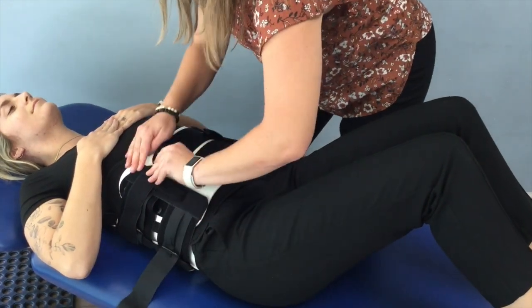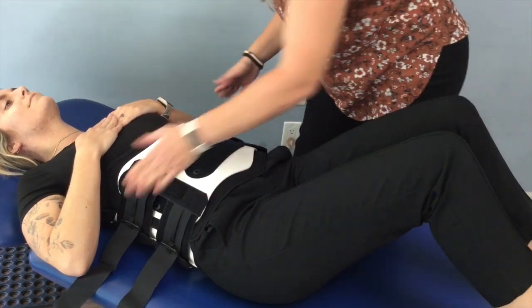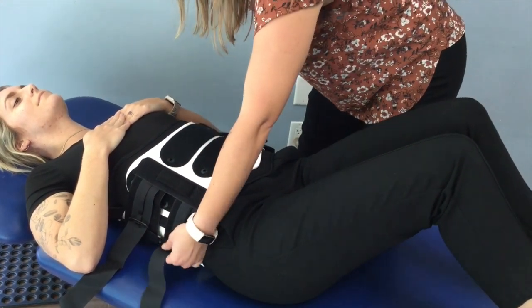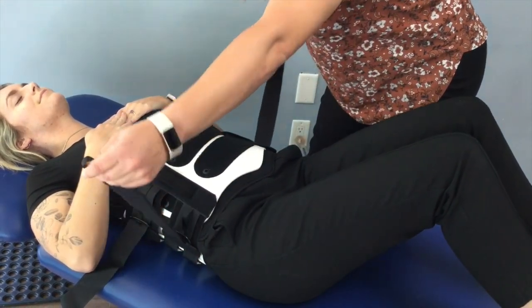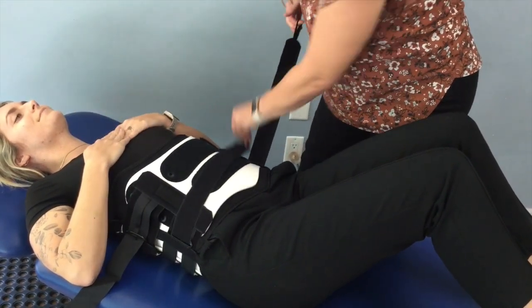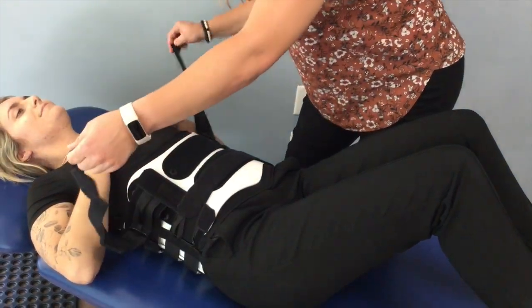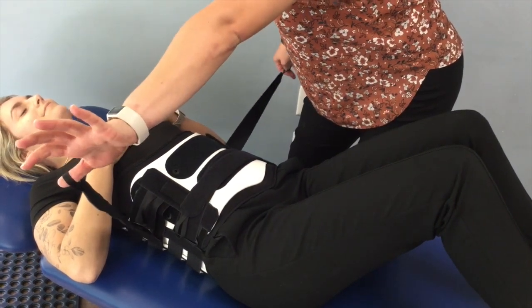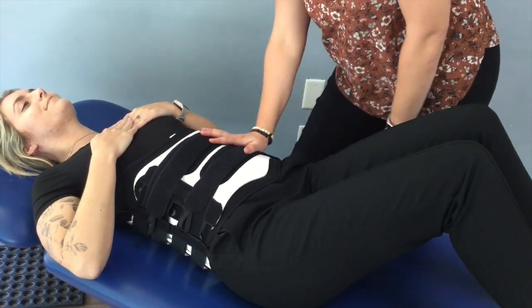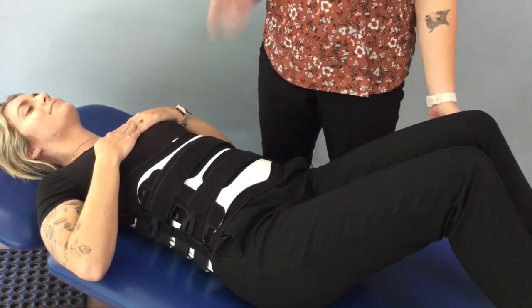We need to tighten the two straps on this brace — a top strap and a bottom strap. This is going to apply abdominal compression and secure the brace to her back. I'm going to pull equal pressures on the bottom strap to pull the slack out of the strapping. This material is Velcro-sensitive so it can stick to itself. We're going to do the same thing with the top strap, pulling the slack out and applying it anywhere on the front since it will all stick to itself. This patient is now secure in her brace, and we can begin to mobilize.